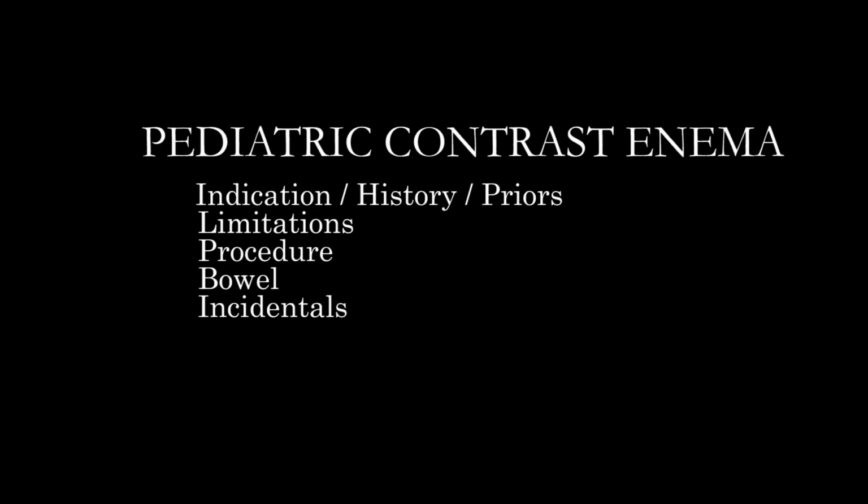Okay, so just as a quick recap, the pediatric contrast enema is, a lot of it, understanding what's going on with the patient and then the procedure itself. We touched on some of the highlights of how to get that started and instill the contrast, and being sure to look for all the potential abnormalities you may see that could explain distal obstruction. Obviously, usually imperforate anus or things like that.